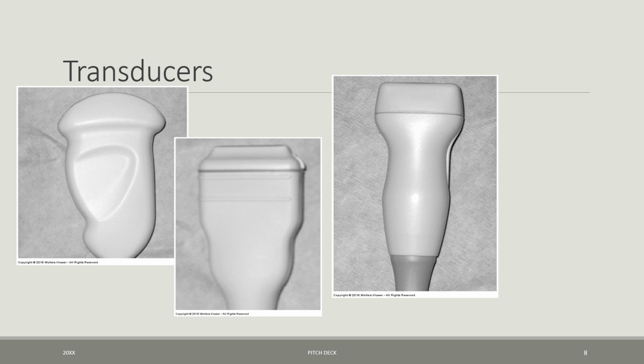You might not think about the curvilinear as much, but when we're getting to those intra-abdominal organs, that's going to be very useful, as well as sometimes when we're looking at thicker body parts like maybe the thigh or the pelvis. And then these are going to be our workhorses, the shallow superficial transducers. That's because we get higher frequencies with these linear transducers and lower frequencies with these curvilinears, and we're going to have to select depending on how much penetration we're looking for with a particular exam.